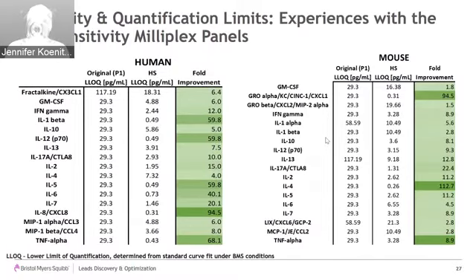As you can see, most of the analytes have a vastly improved LLOQ, in some cases by 50 or more fold. Some analytes for which this has been especially helpful are IL-10, IL-12 p70, IL-4, 5, and 6, where we routinely use these high sensitivity analytes to get a better understanding of our samples.